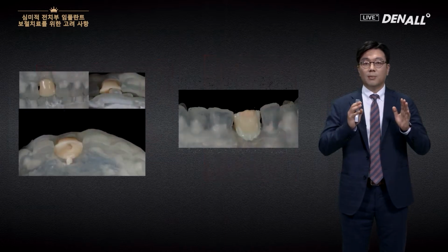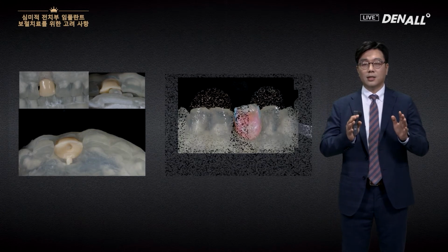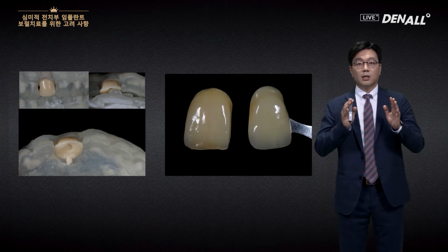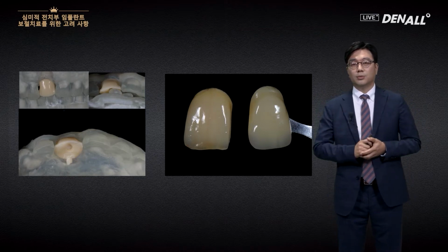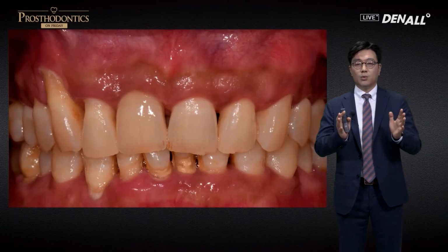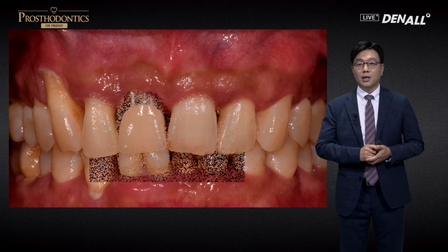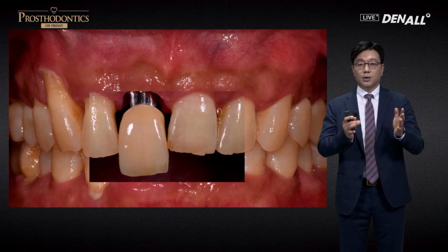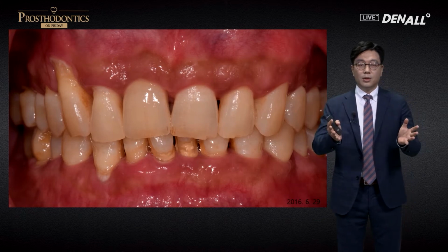In the process of fabrication, the efforts of lab team is required. The lab team is basically focused on the white aesthetics. This is not a bad prosthesis. The contour is okay. Not only the white aesthetics.